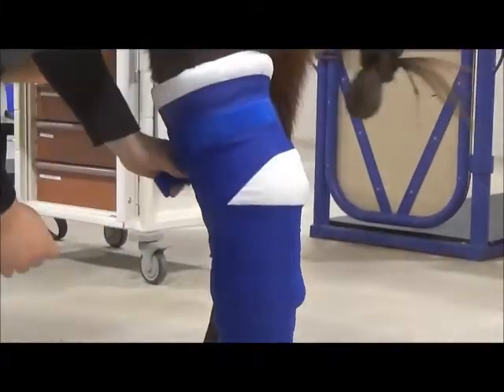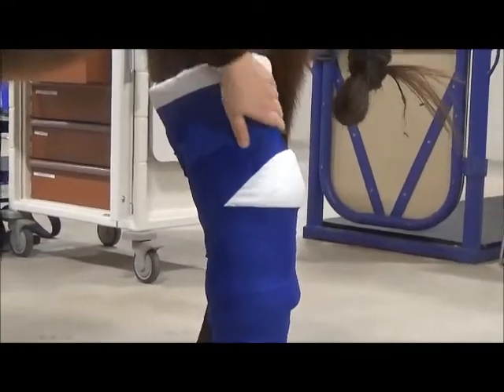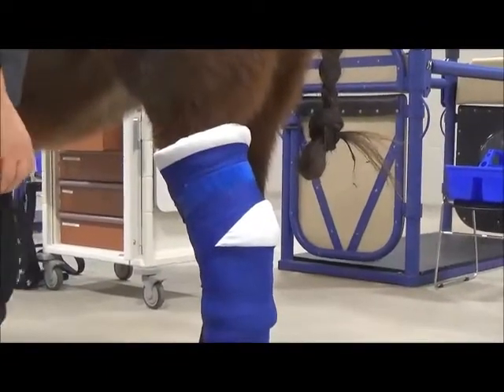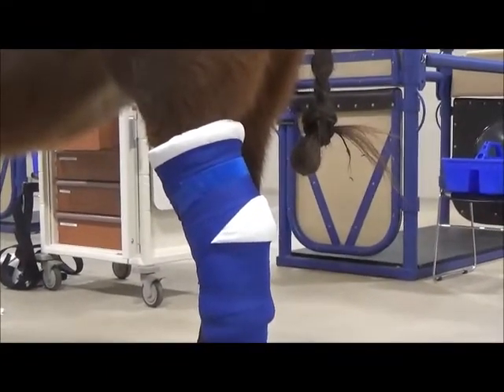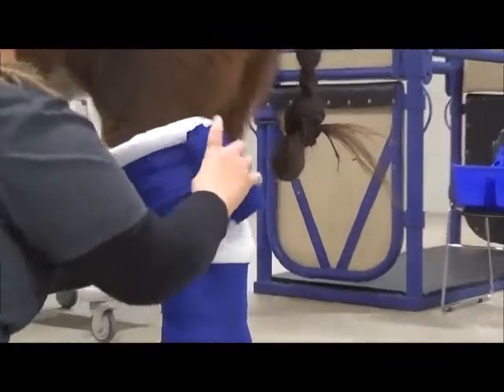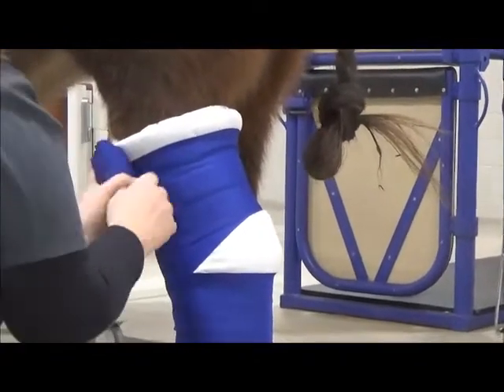On these wraps, the most common places for horses to get pressure sores are right on the back of their hamstring or the gastrocnemius area. So it's important to make sure that you keep even tension in that area. So I'm going to cover the Velcro from the wrap below.